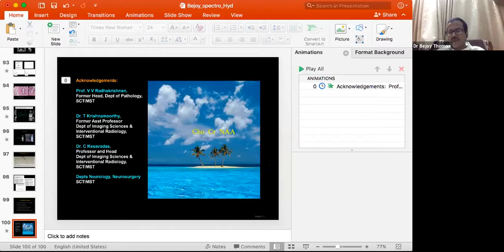You're not going to differentiate between, for example, a phosphoserine peak, which can be seen in tuberculosis, a trehalose peak, which is more specific for a fungal abscess, versus galactitol peak, or something like myoinositol or glycine. In my opinion, it is very, very difficult to differentiate these peaks from the trehalose peak. So I don't look at trehalose peak for diagnosing a fungal abscess.